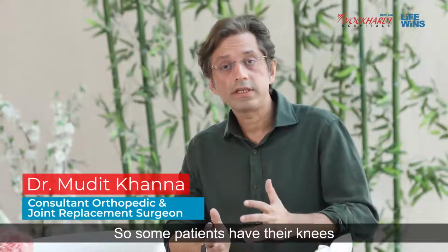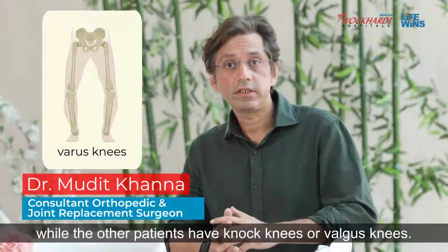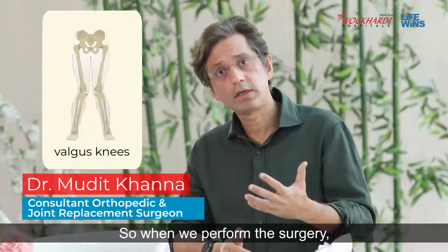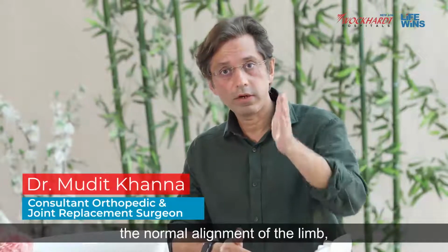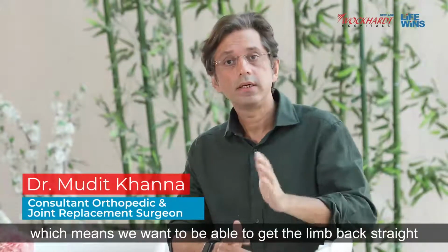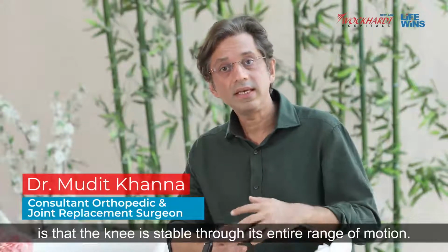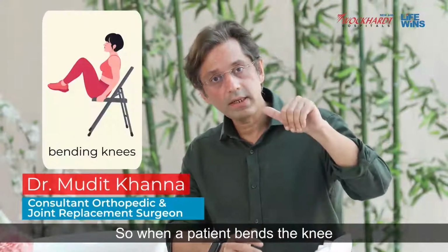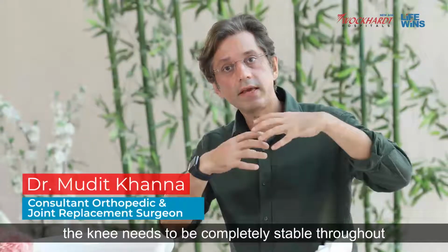Some patients have their knees more as bow legs, or varus knees, while other patients have knock knees, or valgus knees. When we perform this surgery, we want to be sure that we can restore the normal alignment of the limb, which means we want to get the limb back straight to neutral. Also, we want the knee to be stable through its entire range of motion. When a patient bends the knee and when the patient straightens the knee, it needs to be completely stable throughout.